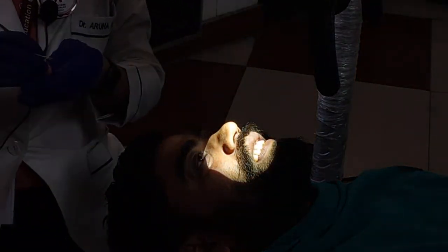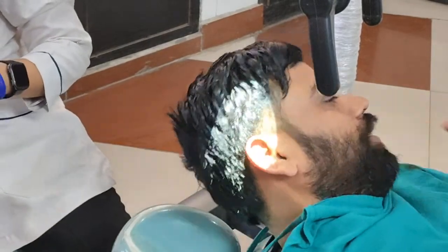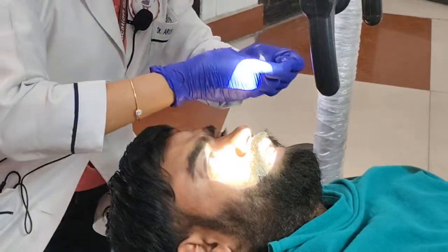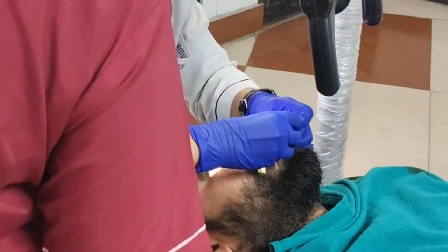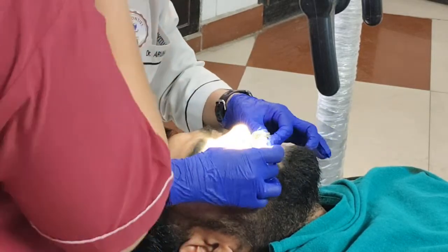So, just give me a minute till I wrap up the patient. Anushka, banana exercise for partial thickness flap using microscope. Here, scaling, then minor surgery, that was depigmentation with banana. And next we will be showing you the surgical part.